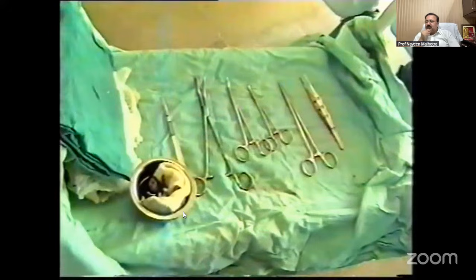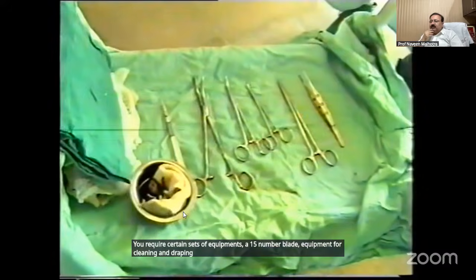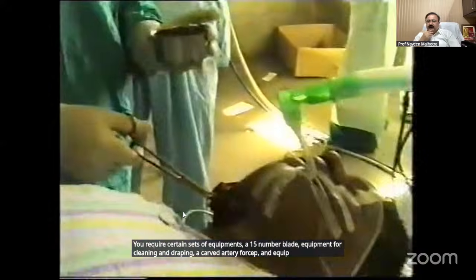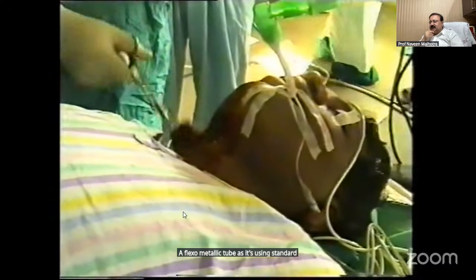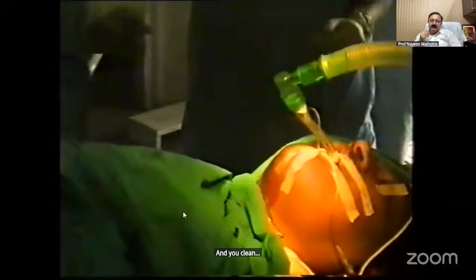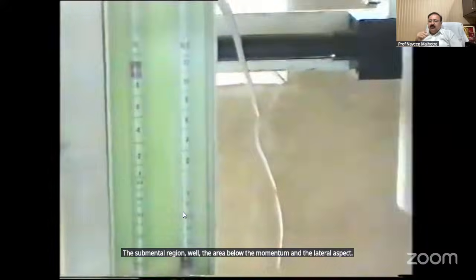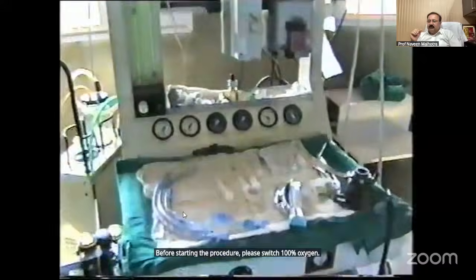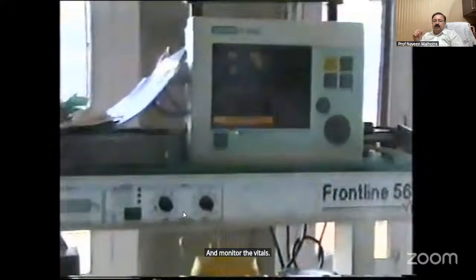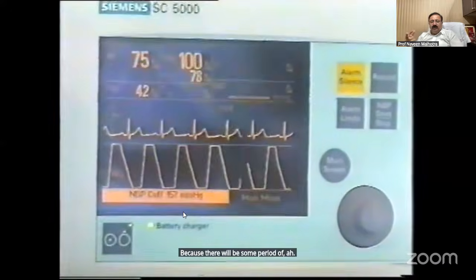You require certain sets of equipment: a number 15 blade, equipment for cleaning and draping, a curved artery forceps, and equipment for suturing. A flexometallic tube has been placed using a standard general anesthesia technique, and you clean the submental region, the area below the mentum and the lateral aspect. Before starting the procedure, please switch on 100% oxygen and monitor the vitals, because there will be some period of disconnection of the tube when you're taking it out.